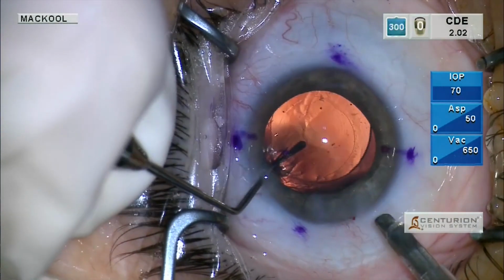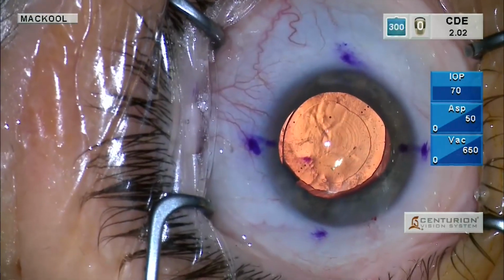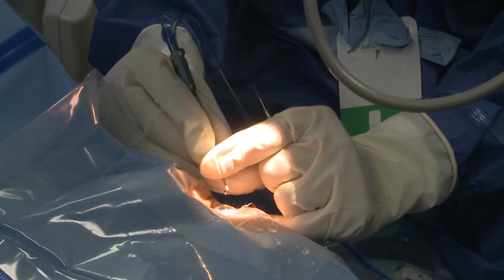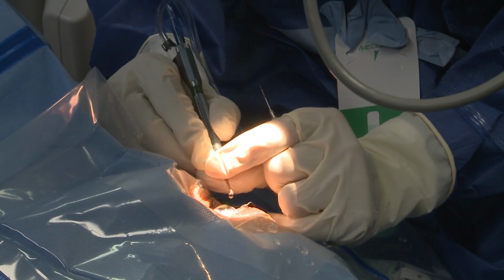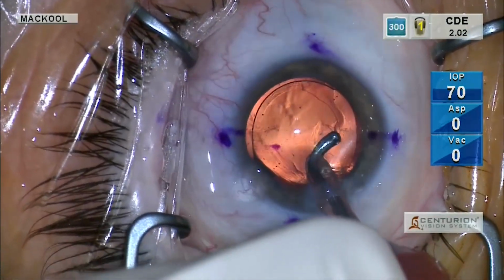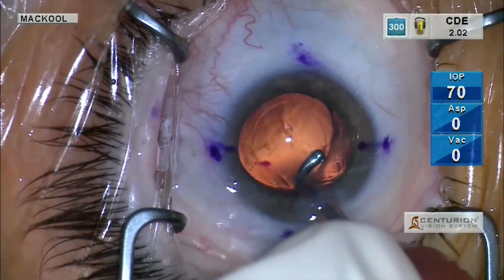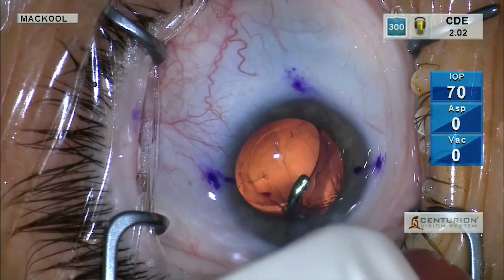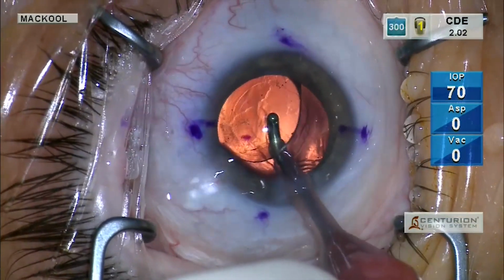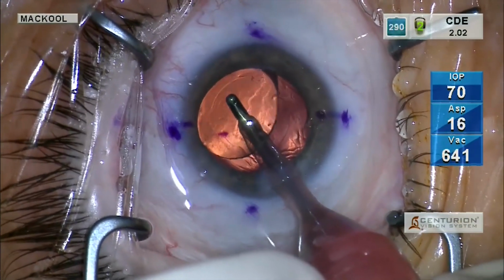And now we're going to leave it shy of the final desired resting place while we remove the OVD from behind the IOL. Very important step to prevent IOP spike, but also with toric IOLs to prevent undesired rotation. So we're just going to nudge the IOL in that direction so we can then slip underneath it, rotate the 90-degree tip. Please keep looking straight ahead at the light. Very good. And remove the OVD from behind.